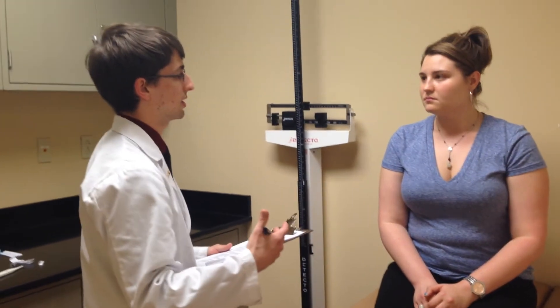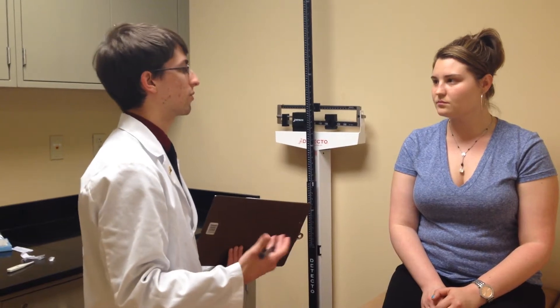I also took your respirations per minute while I was doing the temperature. You have a respiration rate of 18 respirations per minute, which falls in our normal range of 12 to 20. Awesome.